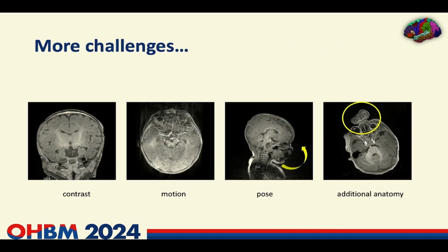A couple more images indicating challenges. So I already talked about contrast, but we can have motion artifacts corrupting the images in case of infants. In case of infants, depending on the age that you are specializing in or recruiting to be imaged, there are certain strategies that you can use in order to not have the infant move. But for most of the studies, we don't use sedation, so the babies can often wake up, so the motion artifacts can be quite considerable, or you have to cancel your scan.